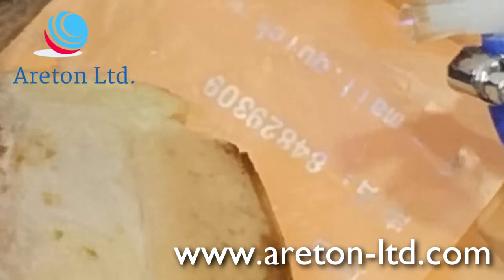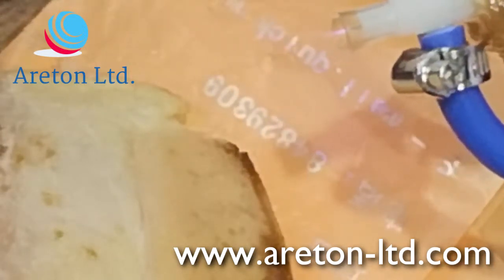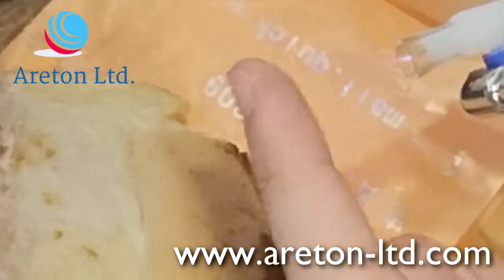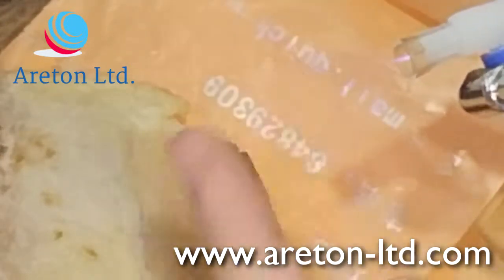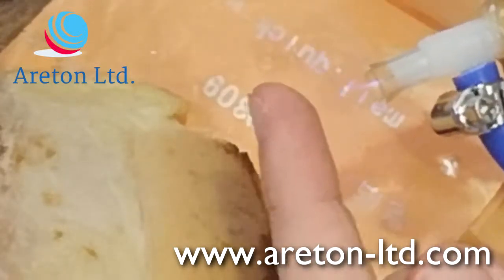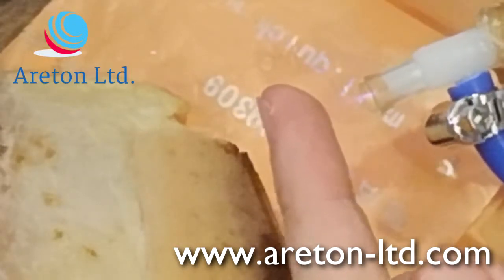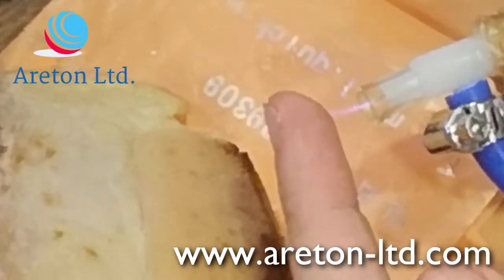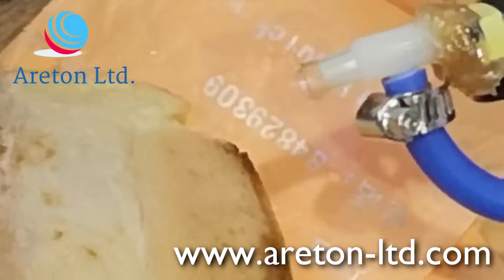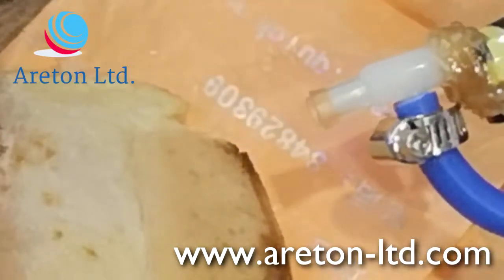At the moment, if you look at the tip of the device here, it's actually arcing. The tip is arcing. It's beautiful. It's arcing towards here. It's arcing towards my finger as well. And because it's not set up 100%, even if there's an arc, it's not detecting it properly. So I'm getting an arc, but it's not detecting it. But look, when the arc is high enough, it's going to detect it, and it switches off.